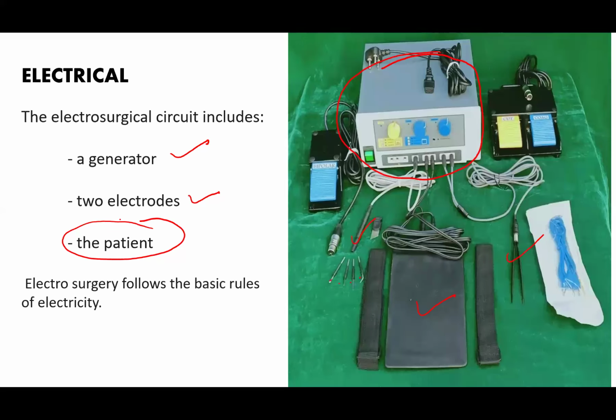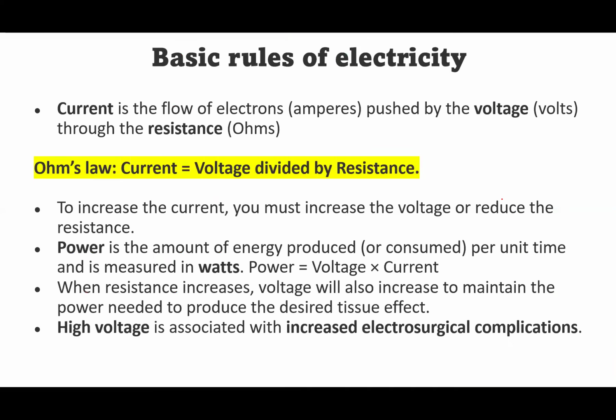Even though these points are applicable for laparoscopic surgery, the handheld devices that will serve as the electrodes are different, designed in such a way that they can be passed through the port and gain access to the operating site. Now, before we go into all those details, let's see the basic rules of electricity.